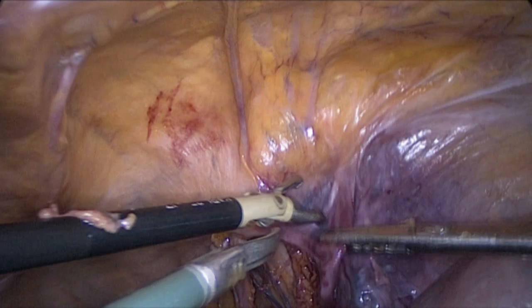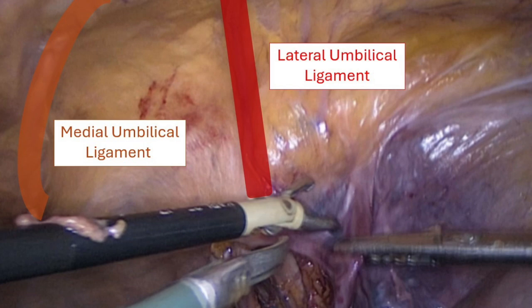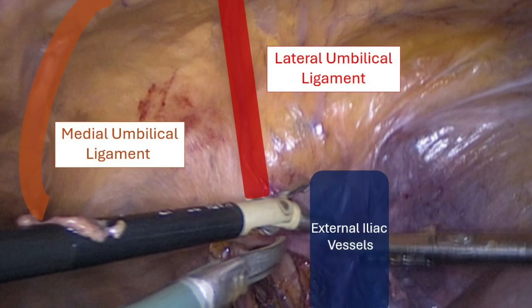Next is the dissection of the inguinal canal. To start, we want to identify the lateral umbilical ligament or the inferior epigastric vessel on the anterior abdominal wall. So here we can identify the lateral umbilical ligament, the medial umbilical ligament, and the external iliac vessels.